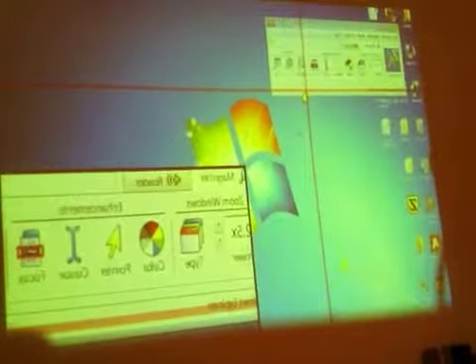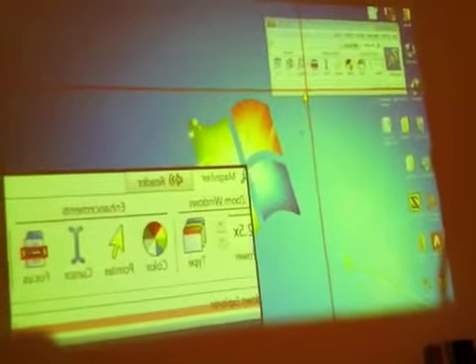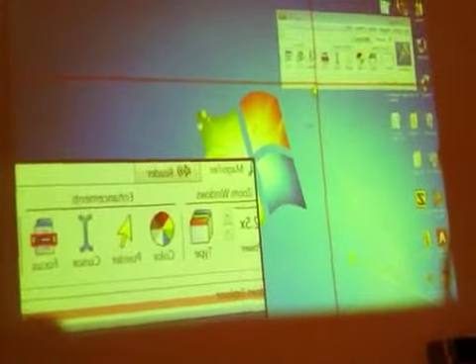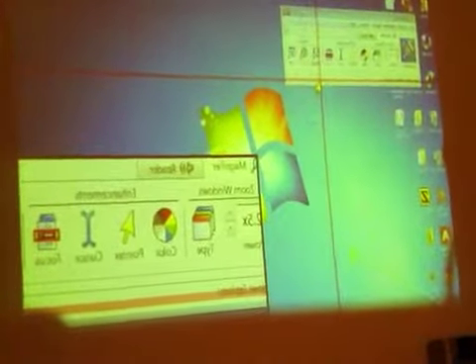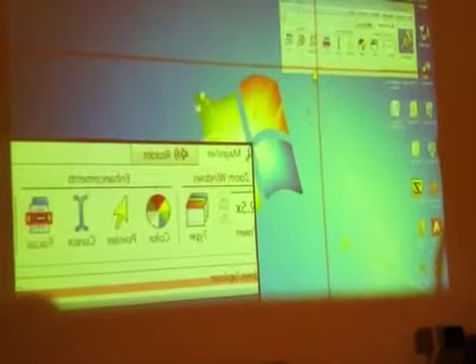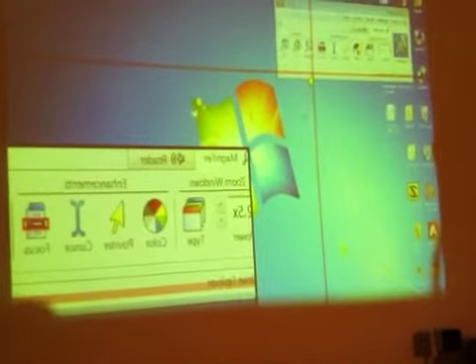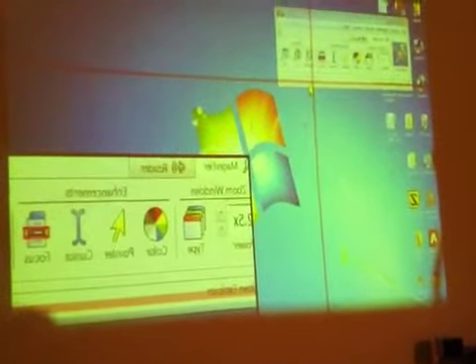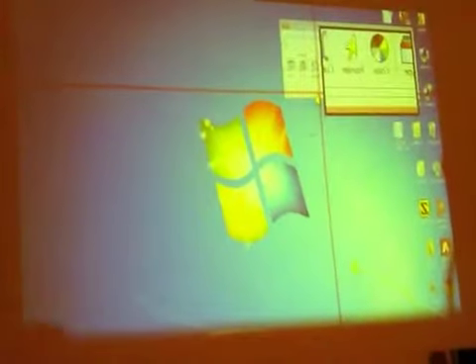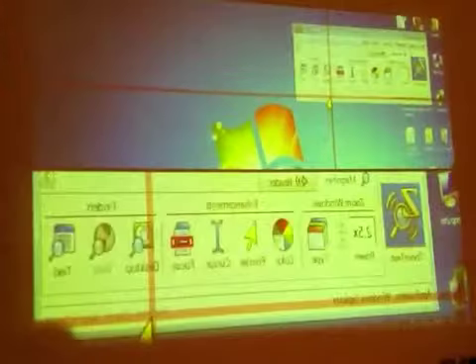If I want to read something at the bottom here and make that large, I can just press the ZoomText hotkey, Control+Shift+Z, repeatedly to zoom in.